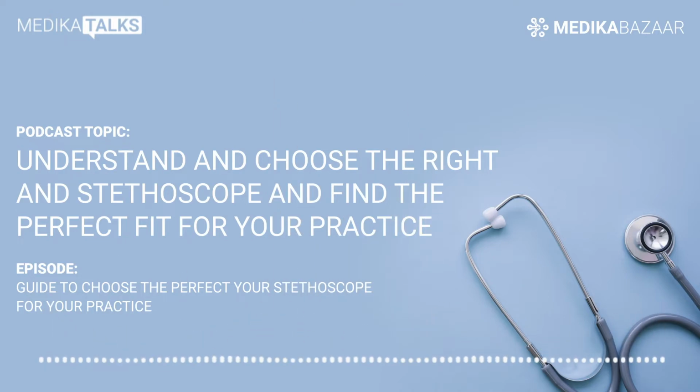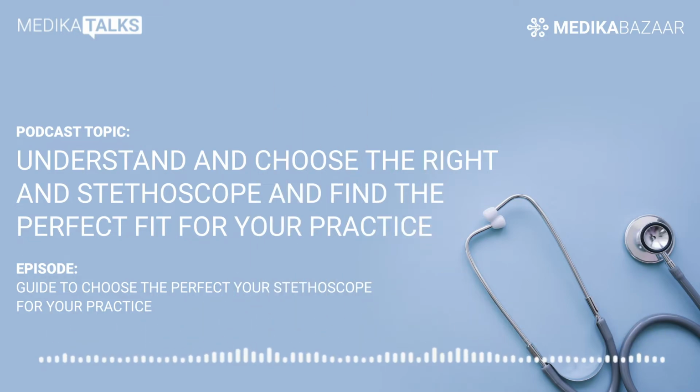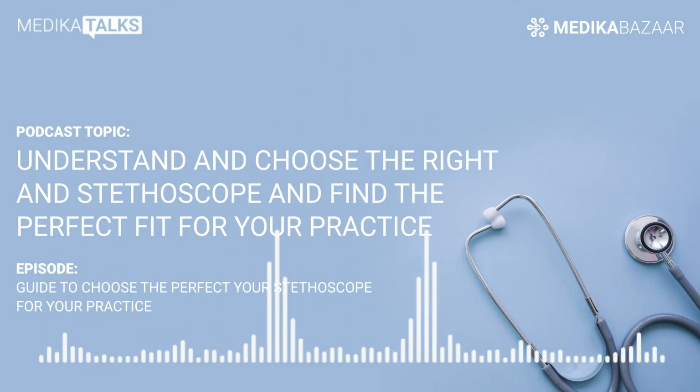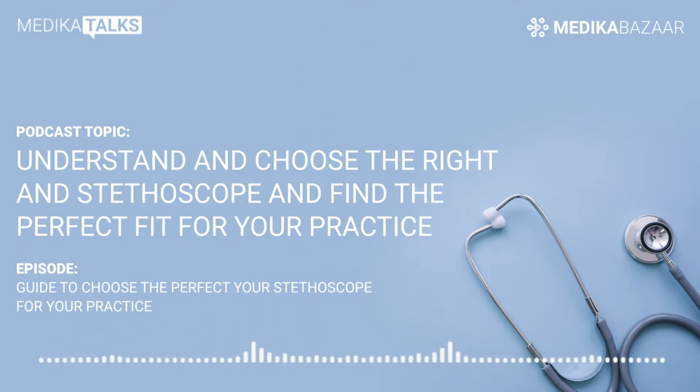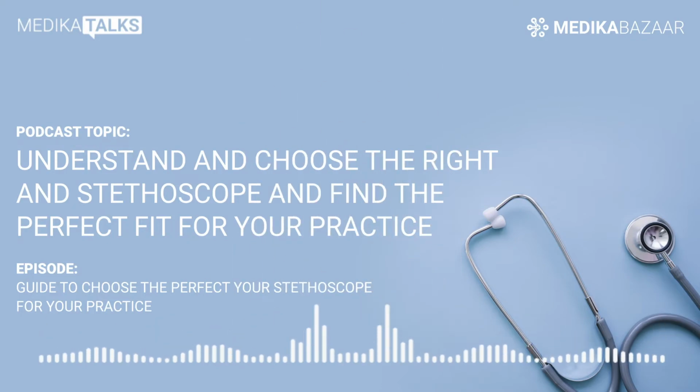Nurses mainly use stethoscopes to evaluate blood pressure. Veterinarians use stethoscopes akin to traditional mechanical stethoscopes that are only suitable for the auscultation of certain types of animals. Physiotherapist. Before and after a session, physiotherapists use stethoscopes for pulmonary auscultations. Since their auscultation is pulmonary, they generally opt for a single head stethoscope.